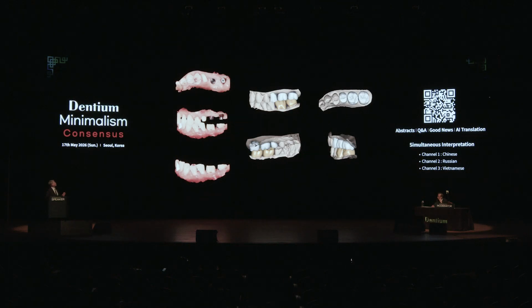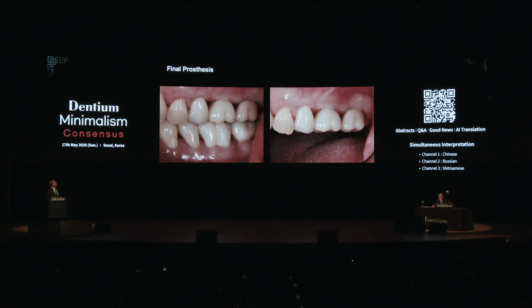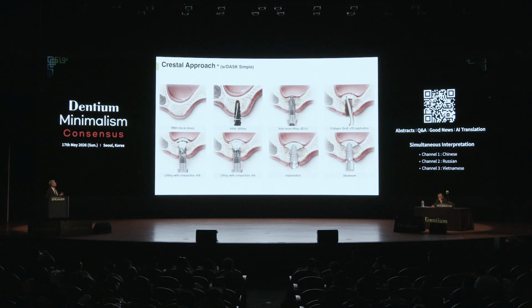As you see, this one side is a freehand case, and with the zirconia, milling and sintering, and placed into the mouth, we have a very good occlusal contact. About the details of how to take very precise occlusal contacts in freehand cases, this time I will only briefly cover the concept. However, placing narrow and short implants with the Bright implant system is very satisfactory.